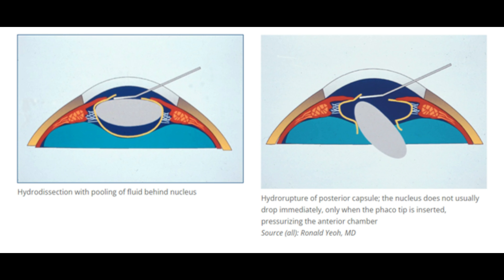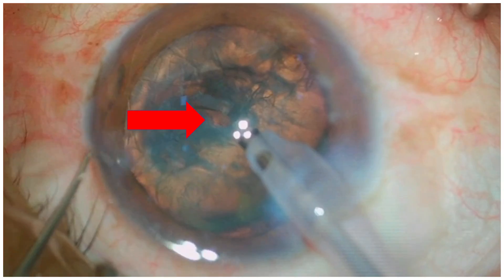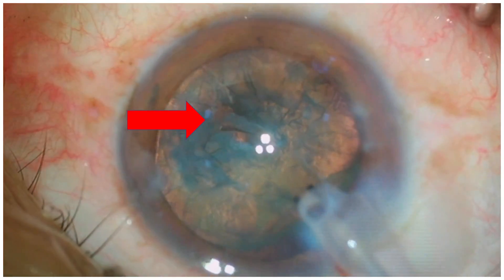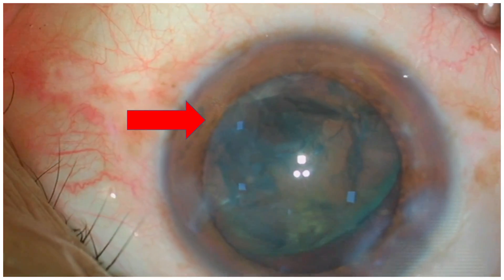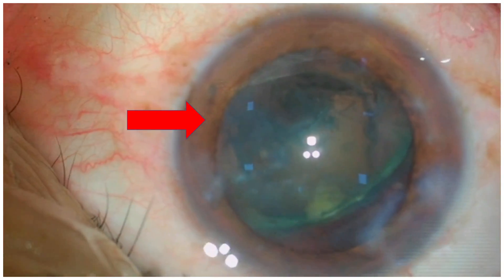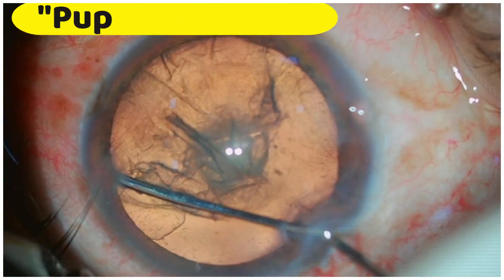But if the surgeon continues to inject fluid, then hydro rupture may occur, like it happened here. What you see here is the posterior lag sign and impending drop of the nucleus.